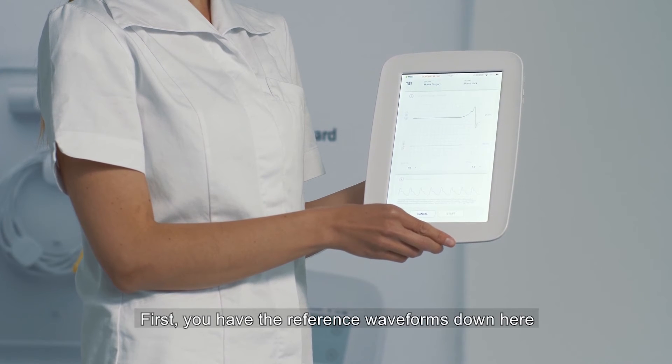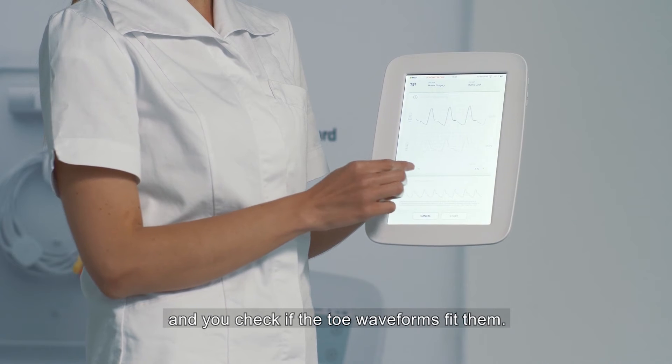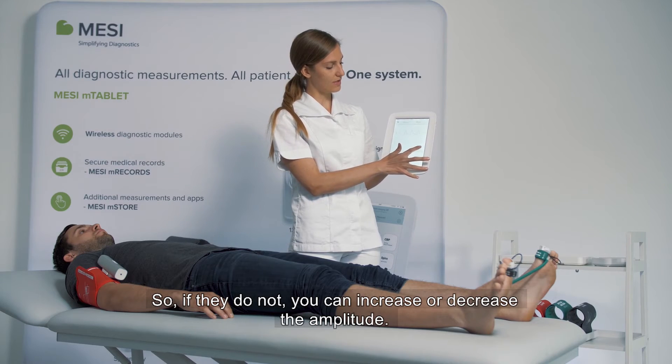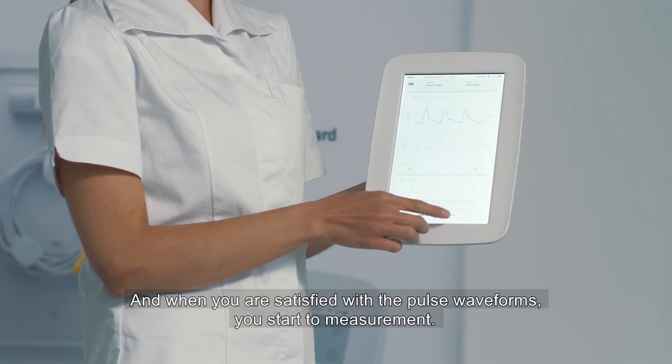First, you have the reference waveforms down here and you check if the toe waveforms fit them. If they don't, you can increase or decrease the amplitude. And when you're satisfied with the pulse waveforms, you start a measurement.